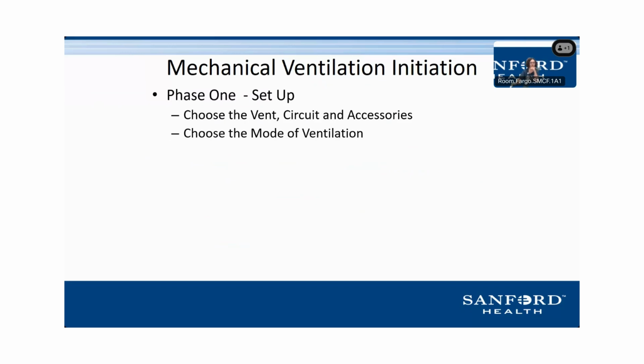Okay. Then we're going to choose a mode of ventilation, and not all vents have a lot of choices. There are some ventilators that only do pressure ventilation, and there's some ventilators that only do volume ventilation. So the mode we'll talk about a little bit, but otherwise that is going to be based on which ventilator that you choose. We're going to get some initial settings. We really don't know what the patient's going to need for initial settings until we actually get them on the ventilator and see what it looks like.